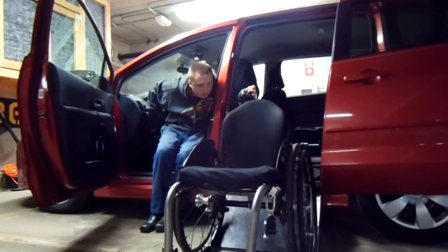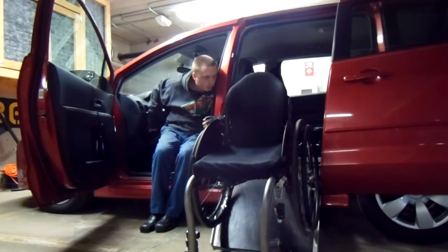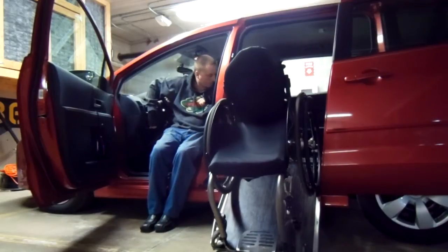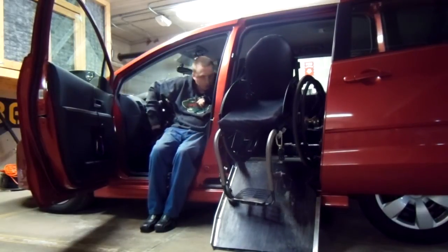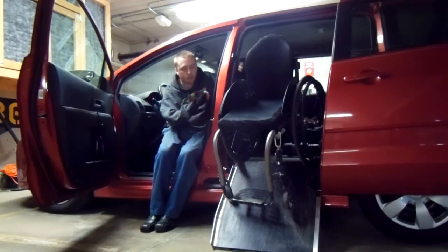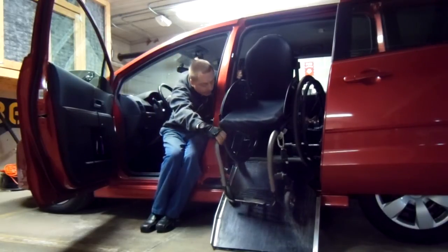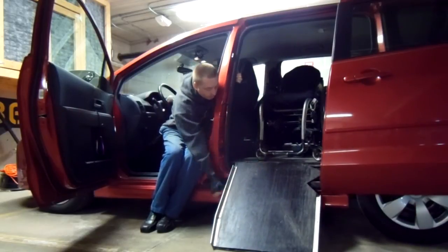I hold the tension on it so it's up against the ramp, then let the winch do all the work. I pull it up to the point where when I get out of the vehicle I want the chair to come down to this level — that's how far I pull it in. Then it's pretty light at this point — just shove it back in the rest of the way and flip up the ramp.